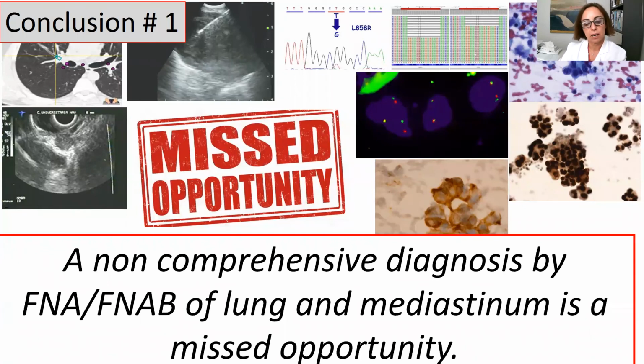And here are my conclusions. Conclusion number one is this. A non-comprehensive diagnosis by fine needle aspiration biopsy of lung and mediastinum is a missed opportunity for us, of course, but also, and most important, for the patient.